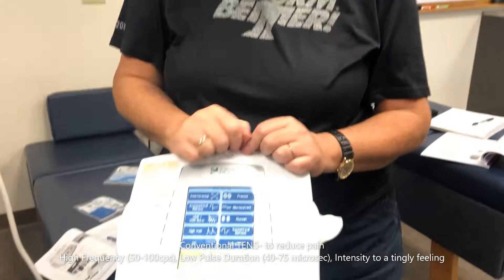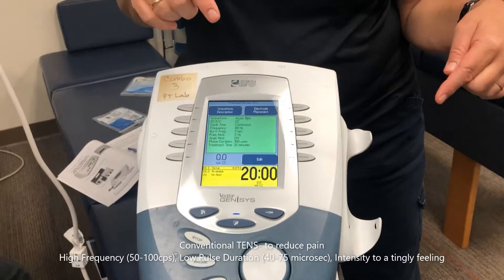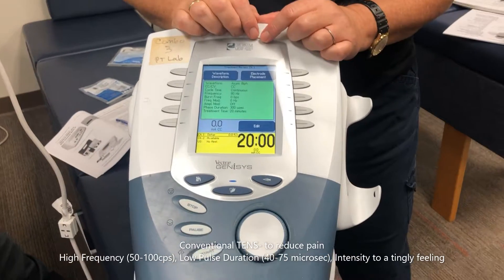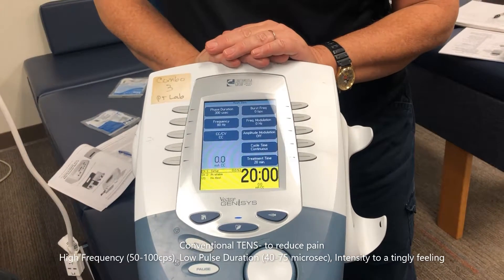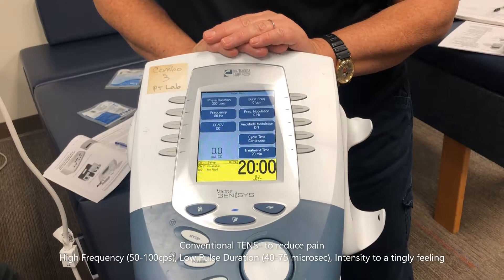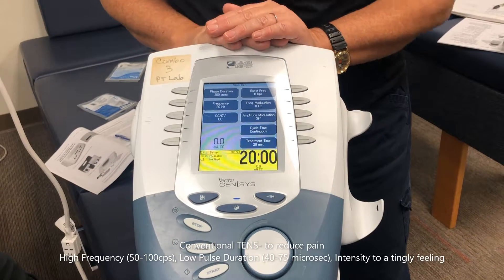These two screens are identical, so I could go to either one — choose edit — and set all the parameters. Looking at my conventional chart, it says 50 to 100 hertz for this setting.